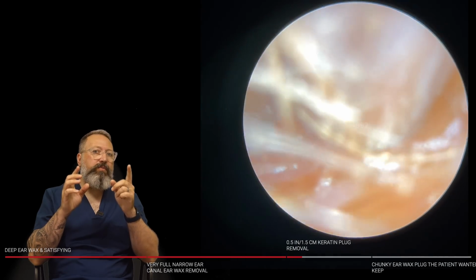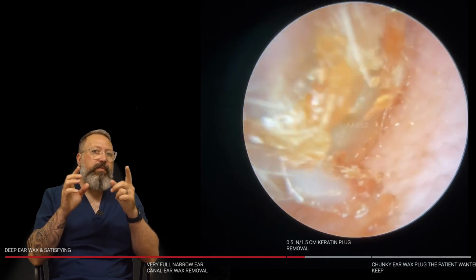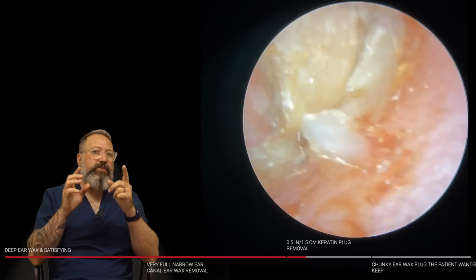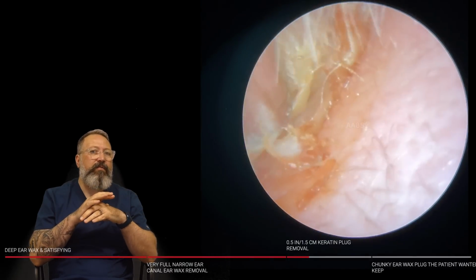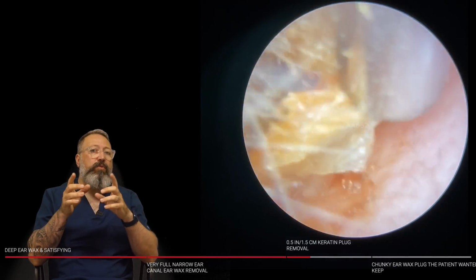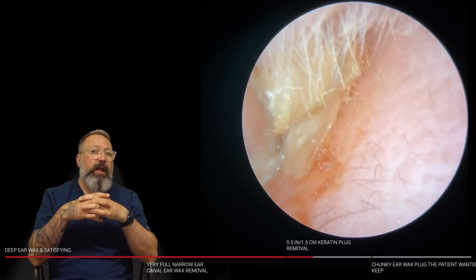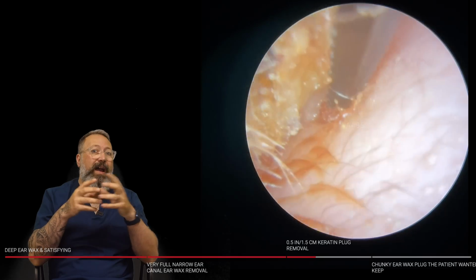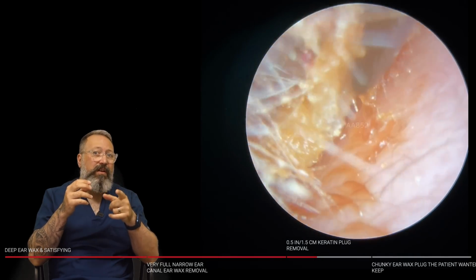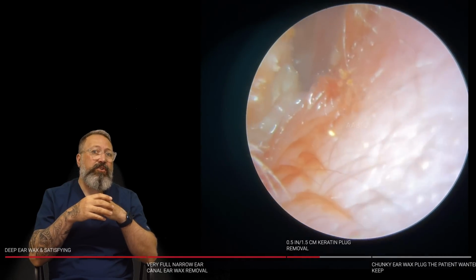I think what happened here is when he took the knock to the ear, he had a bit of trauma inside, and that interrupted the migration of the skin. So what we've ended up with now is a very thick keratin layer that's completely covering everything in here. The gent did go along for some irrigation, didn't get it out, unsurprisingly, because it's skin. I'm holding on to this, but it doesn't want to budge, so we're having to bring the forceps in here. Have a look at this keratin plug that comes away now in a second. So I'm just unfolding the edge there, see if I can get a good grip.